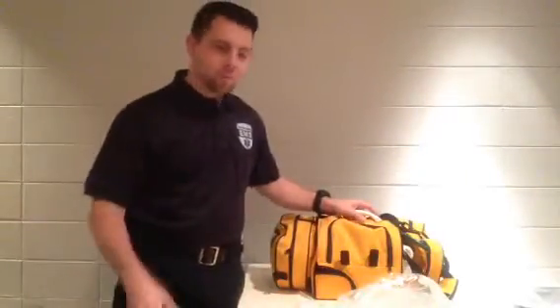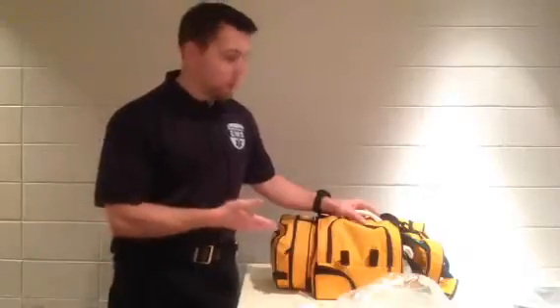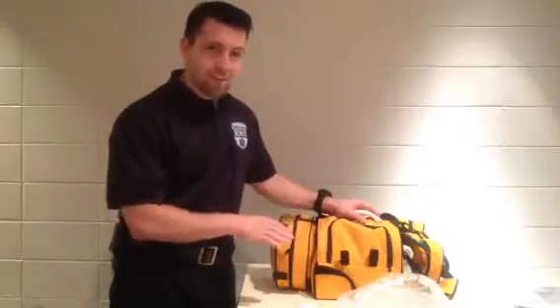Hey guys! Good afternoon and welcome. My name is Gary Peterson and today we're going to be going over the HT70 Plus ventilator.